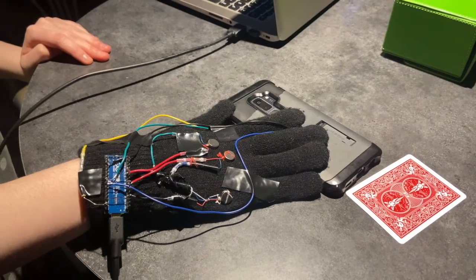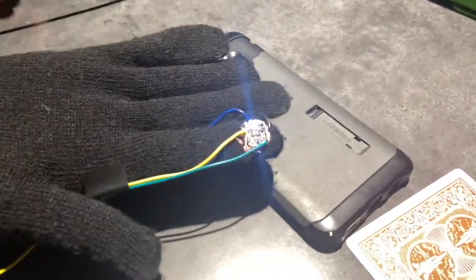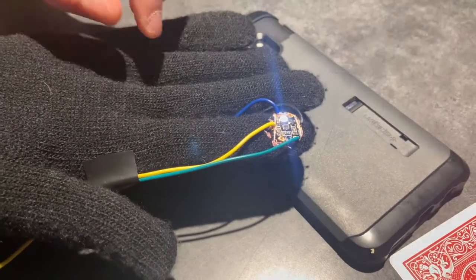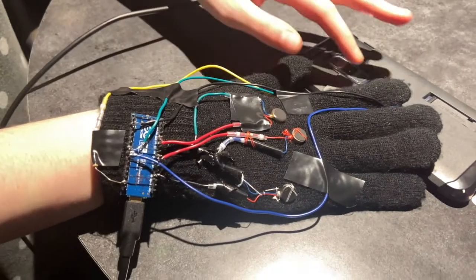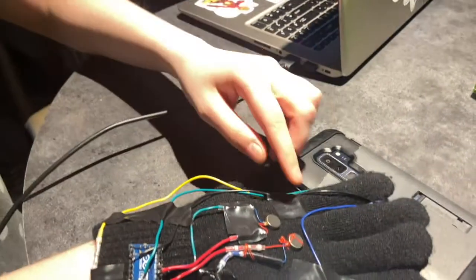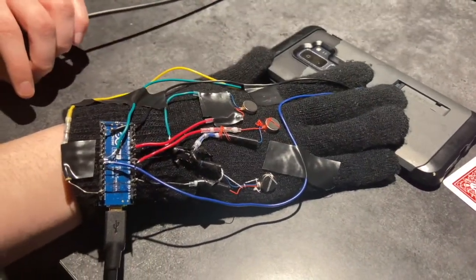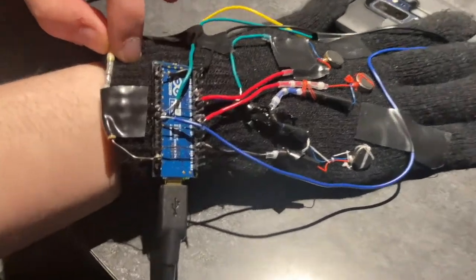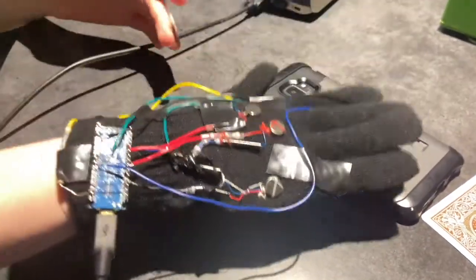Alright, now let's get into some of the hardware of this glove. On the back, we have our color sensor. It's composed of a light to make sure that the color is bright enough when you're facing it the other way, and that's hooked up to the Arduino here, which is then hooked up to the computer. We have our 3 motion sensors here, which are also directly connected to the Arduino, and we have a resistor here to make sure we're not putting out too much voltage. We don't want to blind anyone with this.